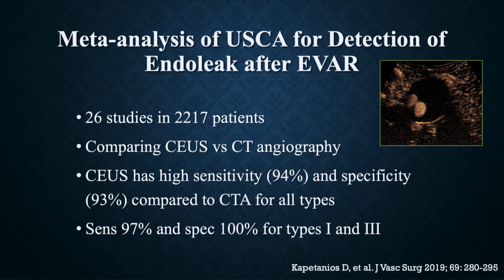A meta-analysis of contrast-enhanced ultrasound compared to CT angiography was done. 26 studies were reviewed. Again, contrast-enhanced ultrasound showed very high sensitivity and specificity, particularly for types 1 and 3. And again, I think some of the decreased sensitivity and specificity is due to the fact that not all of the endoleaks are picked up on CT, but they are real. They're very low flow endoleaks, and contrast-enhanced ultrasound is very sensitive.